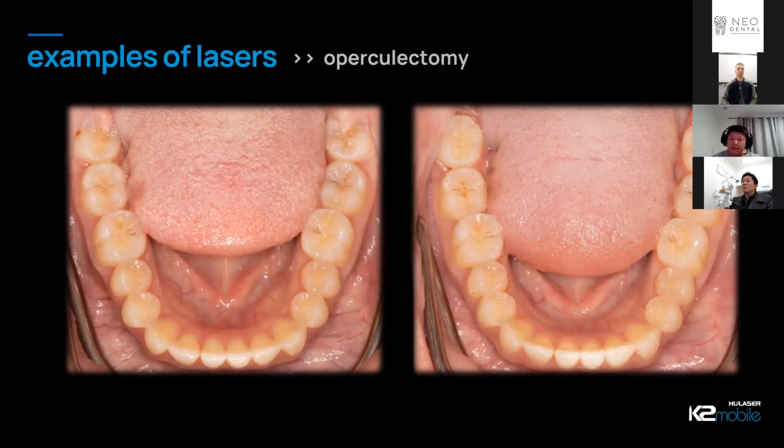I did still have to numb it, although a lot of laser proponents say that the advantage of using lasers is that you don't need local anesthetic. But I might be a bit old school, or a bit too soft-hearted, but I prefer to have them numb so I can work comfortably without having to worry about the patient's comfort.